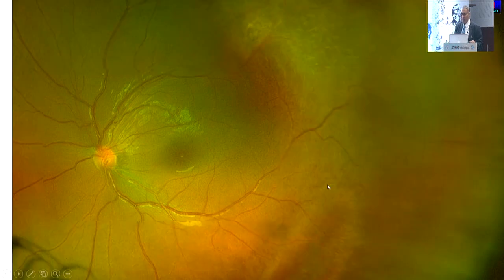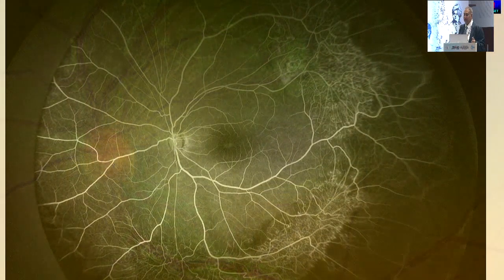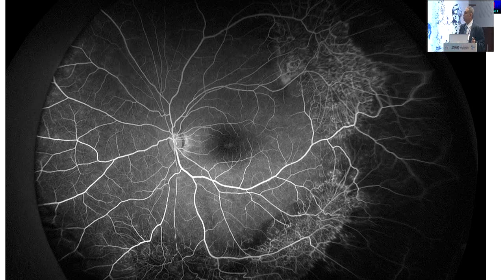And this was the other eye. It looks more like, the first thought was probably we are dealing with FEVR. You zoom in, you can see this bicycle wheel pattern in the macula. We did an ERG. It was more of a retinoschisis, and there are reports describing severe Coats-like response even in retinoschisis. And when I looked at his brother, who also had decreased vision, you can see beautifully with this angiogram that this is not a FEVR case.